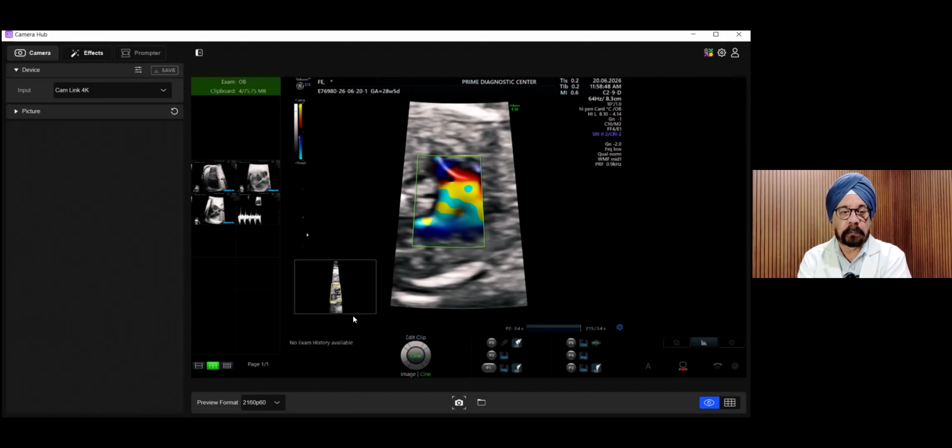There was no abnormality in the umbilical vein. At least it was not opening directly into the inferior vena cava, or into the right atrium. These two ductus venosus shunts can produce volume overload, and we've seen there was no persistent left SVC. That's how you hunt for abnormalities in a dilated RA and RV. We hunted for all abnormalities and did not find any, so now we are rest assured this could be a normal variant.